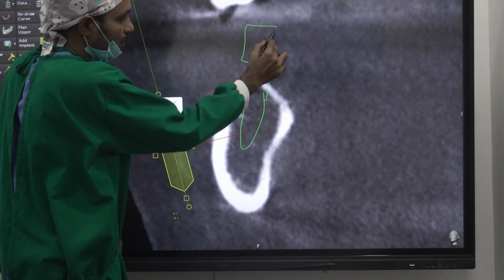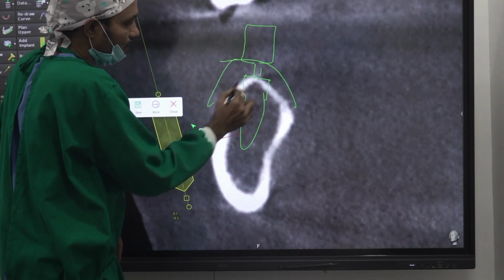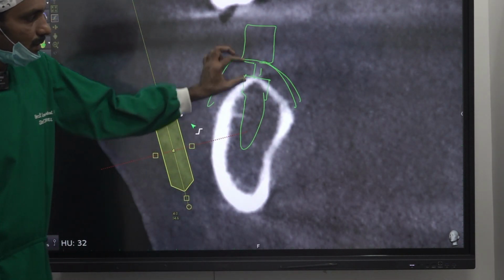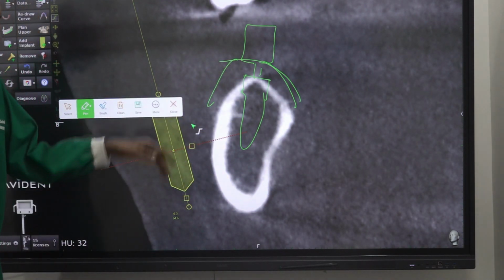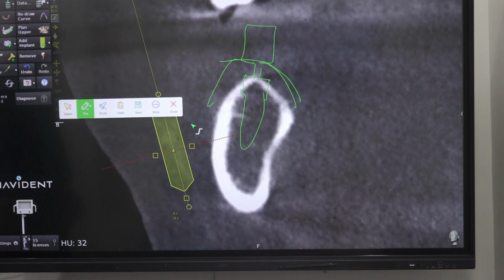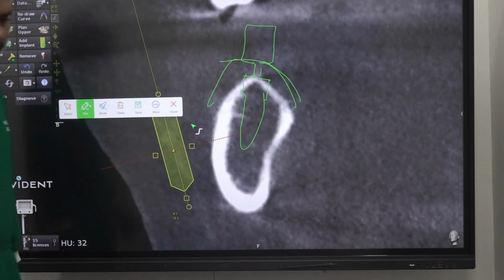Make sure this is the gum. Make sure this is staying back. The moment you go on basal, compressive one, basically it won't get any support here. Where will it get support?